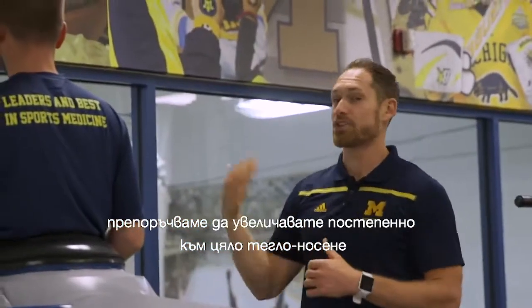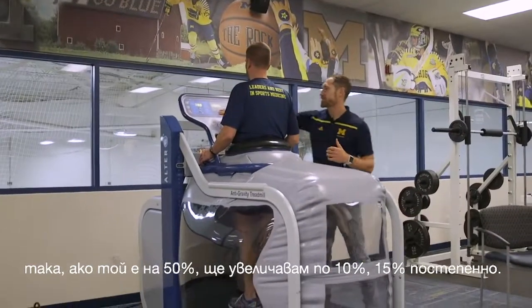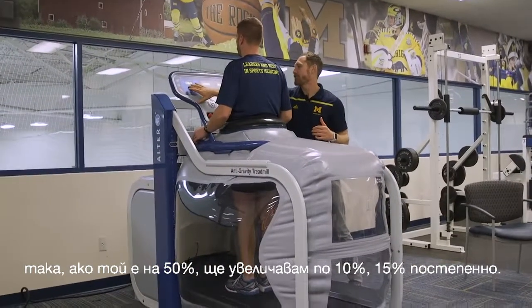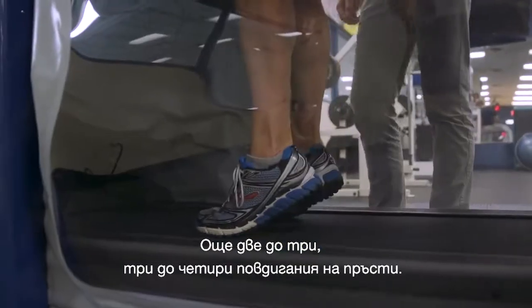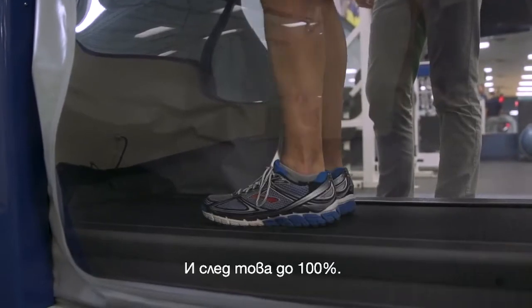Once you're done with your session, we recommend gradually bringing them back up to full weight bearing. So if he's at 50%, I'd go up by 10 to 15% at a time, have him do another two to three or three to four heel raises, and then go all the way to 100%.